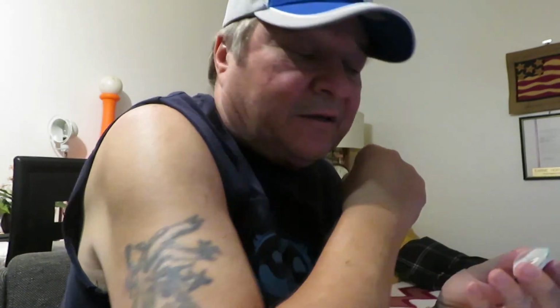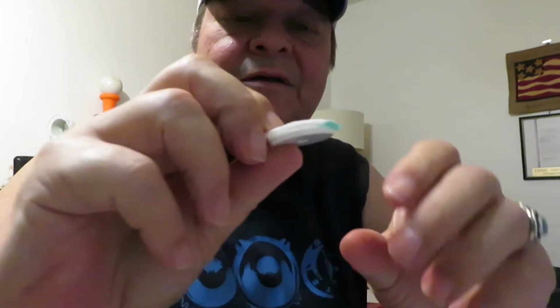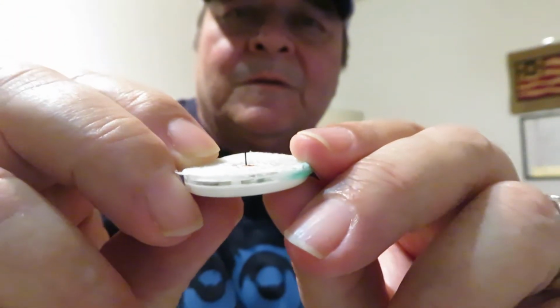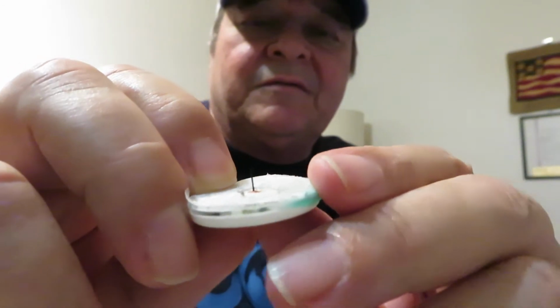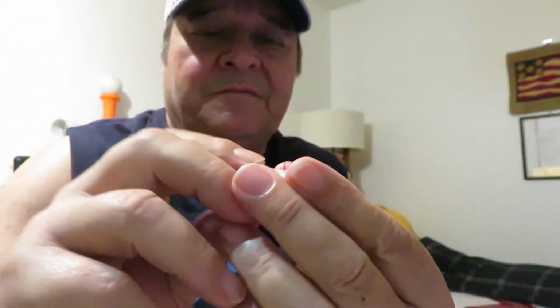Now we got a sleeveless, so let's take this thing off. It's sticky. Pull it off. And then I can see, and there's some of that adhesive. Oh, well, the adhesive came off. Sometimes it'll leave some of that adhesive behind. There's a little bit of sticky there. There's the needle that was in there. Never even saw it, never felt it, nothing. It was fine. So I'll just throw it away.